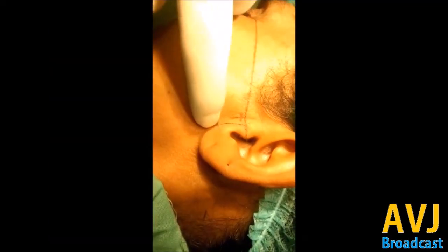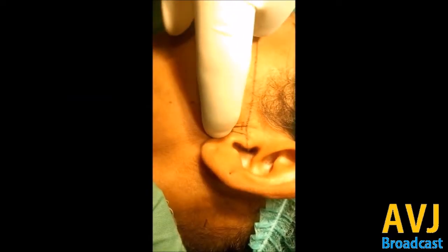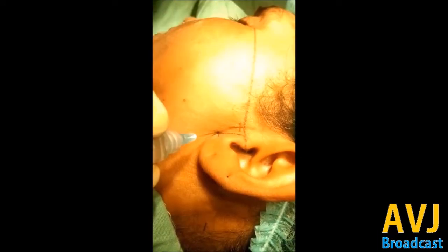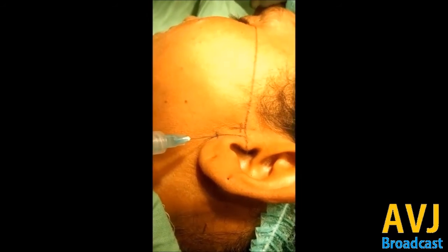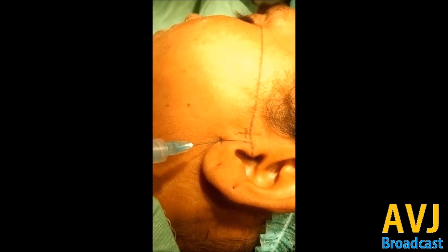Now here is a practical demonstration of the auriculotemporal nerve block. When the patient opens the mouth you will feel the depression 1.5 centimeters below the line from the tragus to the canthus. Hit that area and 0.5 centimeter deep into it inject the local anesthesia. Keep the needle a bit oblique and tilt it superiorly.